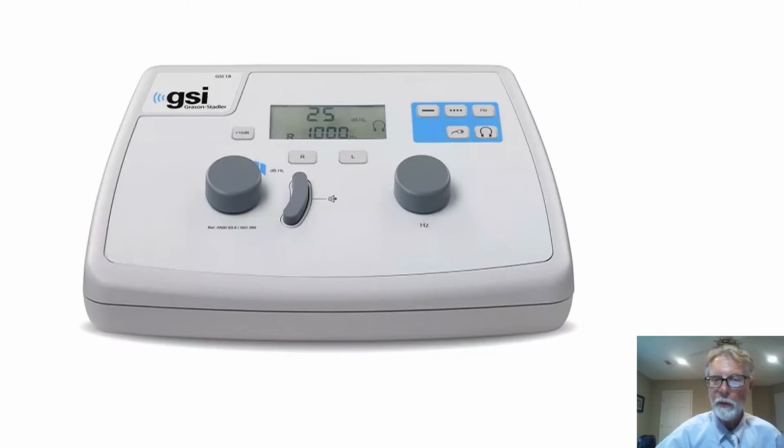And this will go from 0 to 90 or 100 dB in 5 dB steps. The knob on the right is the frequency control, and that will change the frequency from 250 through 500, 750, 1000, 2000, etc., up to 8000.